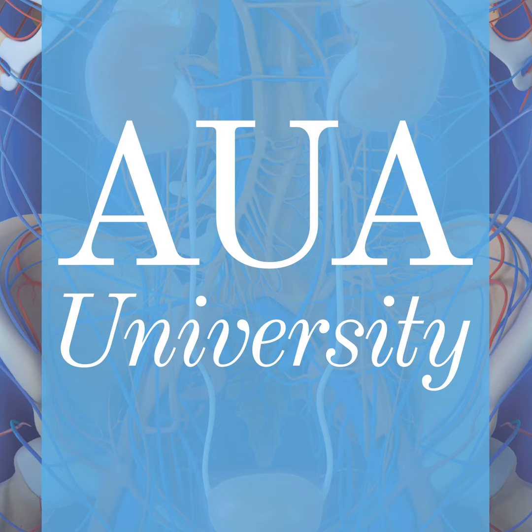The next trial is the OSPREY trial, which is a prospective multicenter study designed to evaluate the safety and diagnostic performance of 18F PET imaging in detecting pelvic lymph node metastases and distant metastatic disease in men with prostate cancer. There were 385 patients eligible overall. Cohort A was the localized cohort, so that's the one we'll review for this. And basically they had 268, I can't quite see it, studies and patients in that cohort.